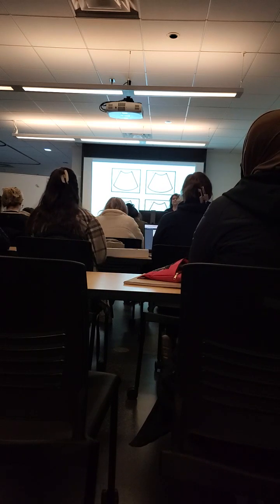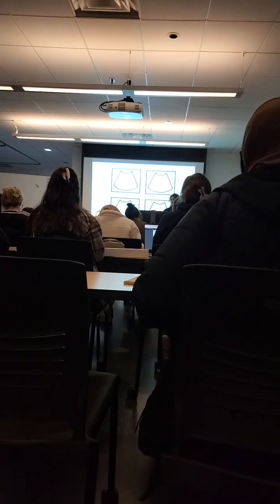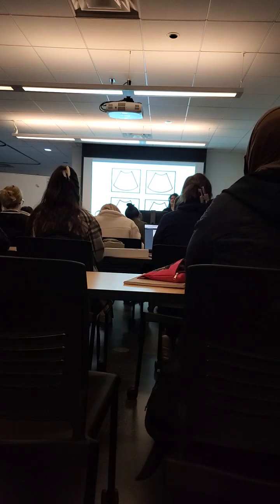Oh, you guys, let's practice. This is the hard part of today. All right. So, I kind of drew kidneys for you already. This is the best I could do with what I had to work with, okay? So the kidneys in transverse are always gonna look like a C, okay? And the kidneys in sag, as you can see, are gonna look like half a pizza. All right. So, the first one, let's do this one together as a team.